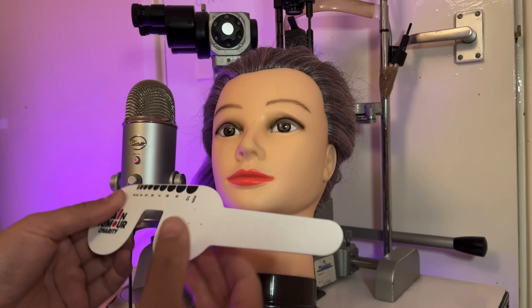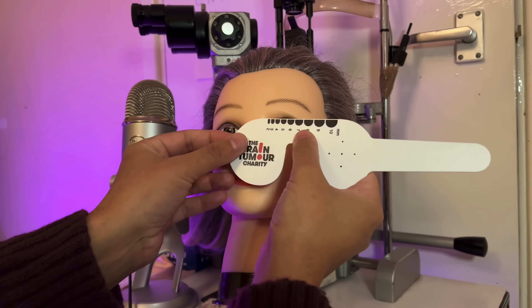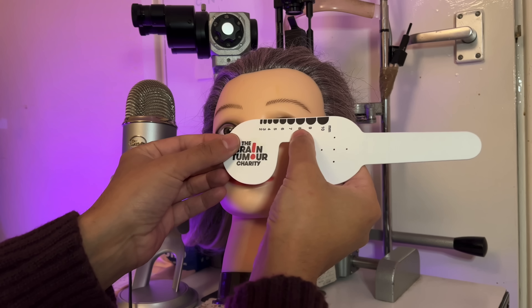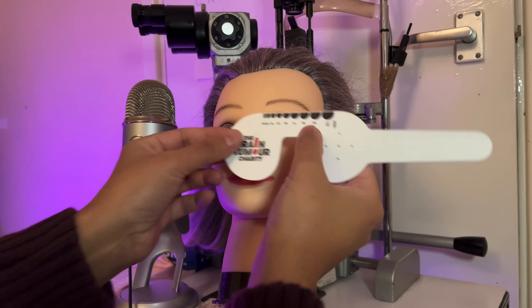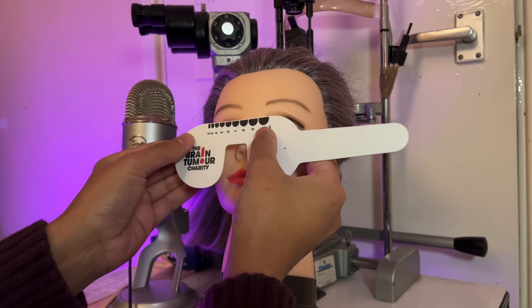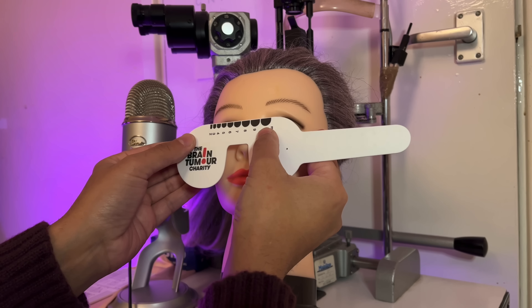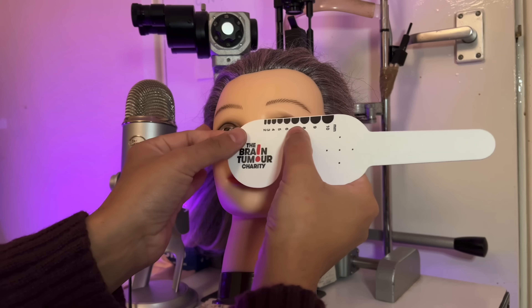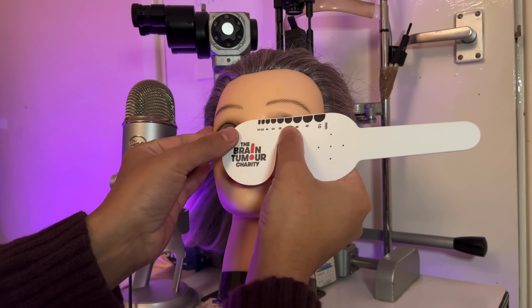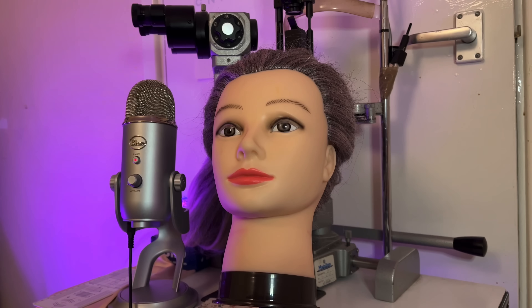The pupil measuring gauge is pretty much self-explanatory. Ask the patient to look into the distance. Take a measurement of the pupil sizes, moving along the scale — probably about a five in the right and about a five in the left. Marvellous.